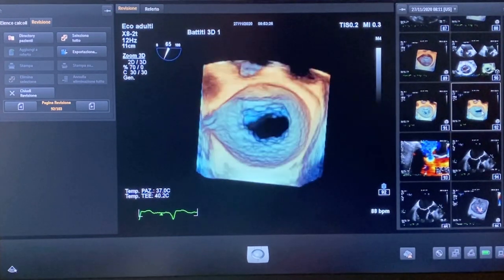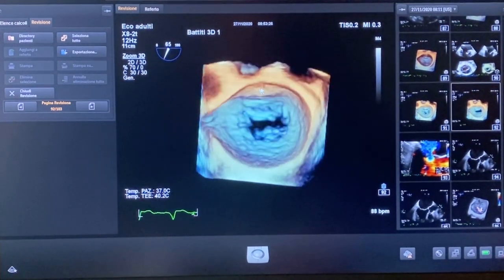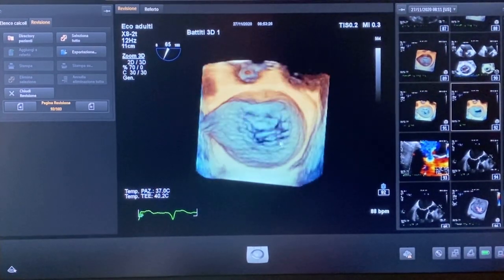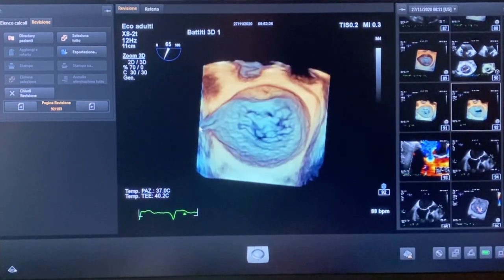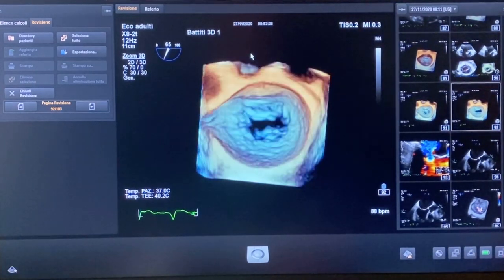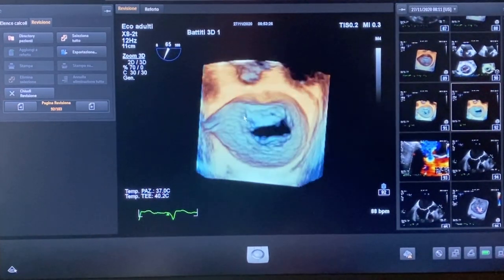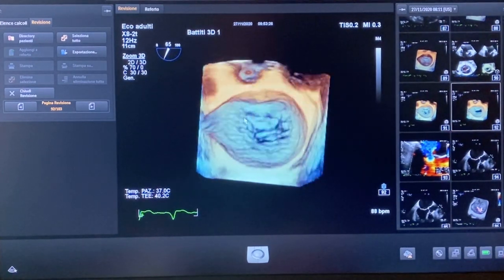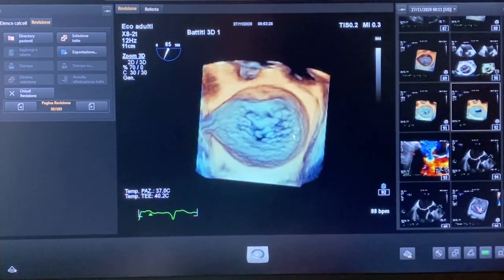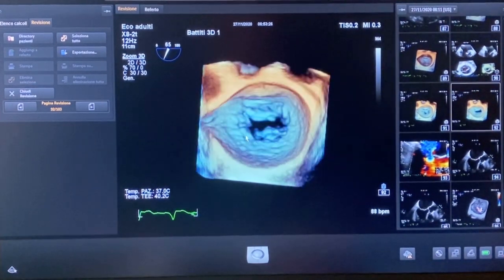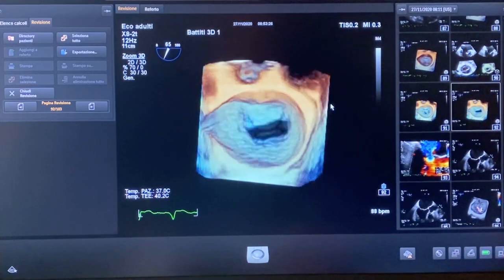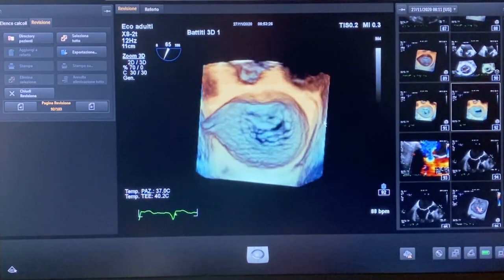This is the surgical view of the mitral valve — the mitral valve viewed from the left atrium. This is the anterior leaflet. On the left we have the left appendage, here we have the tricuspid valve, and at 12 o'clock we have the aortic valve. This is the anterior leaflet with A1, A2, A3, and the posterior leaflet with P1, P2, and P3. A1 and P1 are lateral, close to the appendage. A3 and P3 are medial, close to the tricuspid valve.